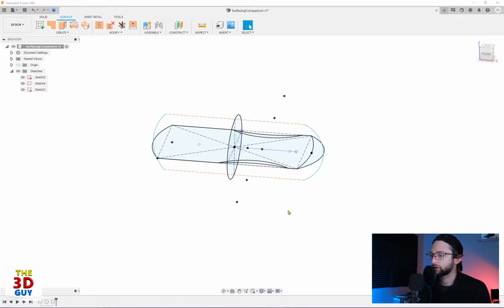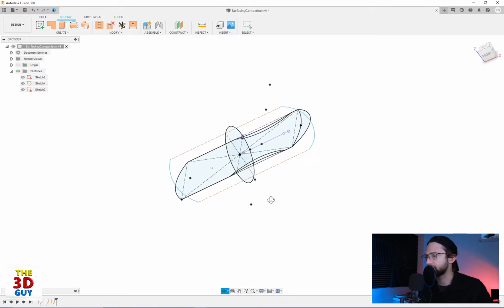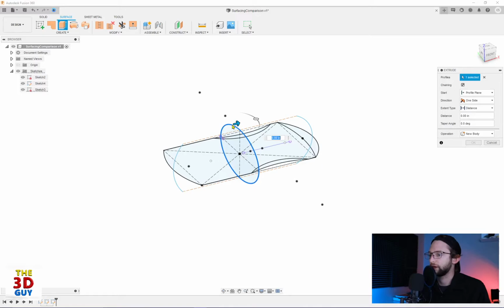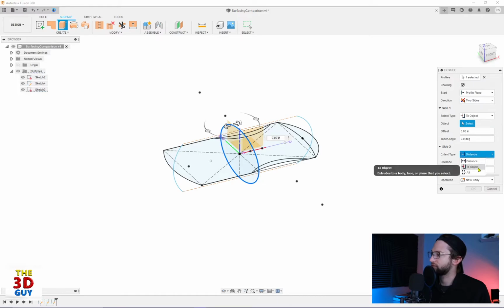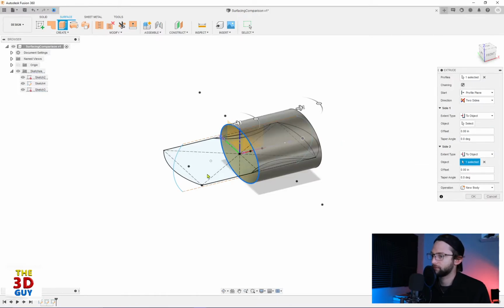Fusion 360, we're just going to go over the same sort of thing. There are some minor differences in the sketches that I've set up, and I don't know if I have as many preset sketches. I don't. So I just have the original three sketches. So we're going to go through and recreate all of the other sketches as we go. So we're going to extrude, same sort of thing. Go two sides, up to object, up to object. So we're going to click up to there.